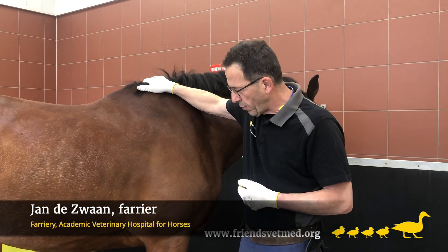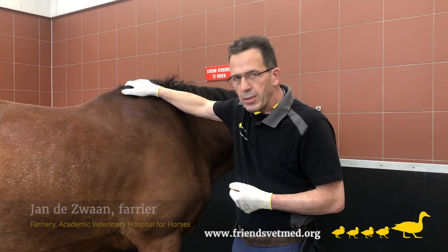Every horse is different. That's why every horse needs individualized hoof care.